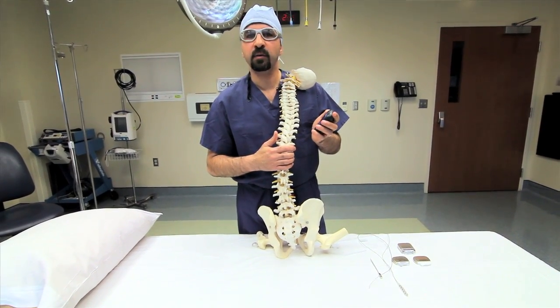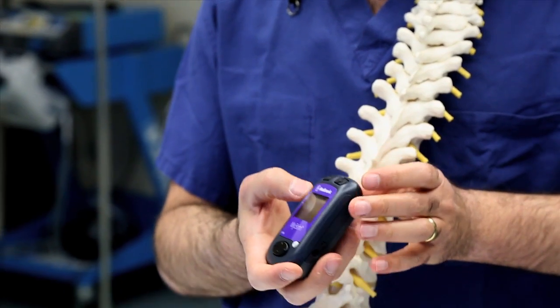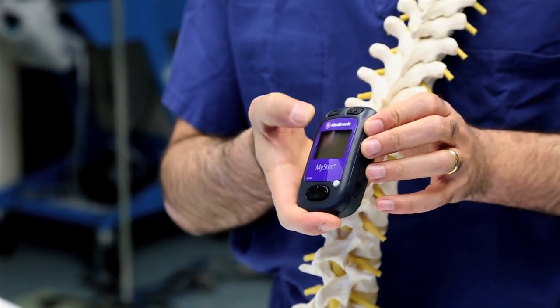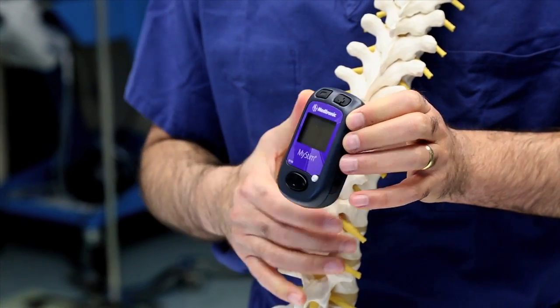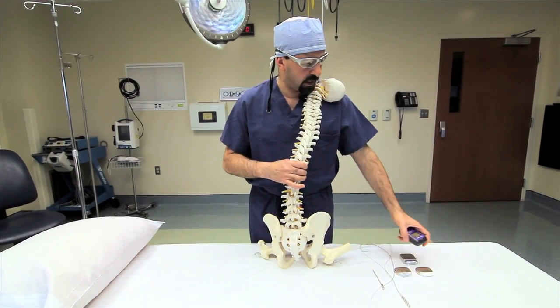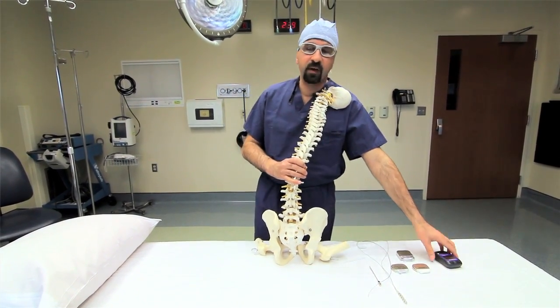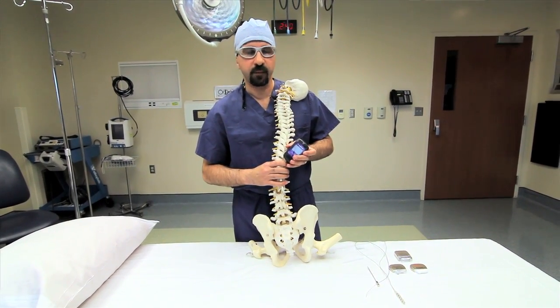We allow the trial for 3 to 5 days. The controller is very simple: the patient goes up with a plus sign and down with a minus sign. The staff from the spinal cord stimulator company will be very supportive and work closely with the patient.